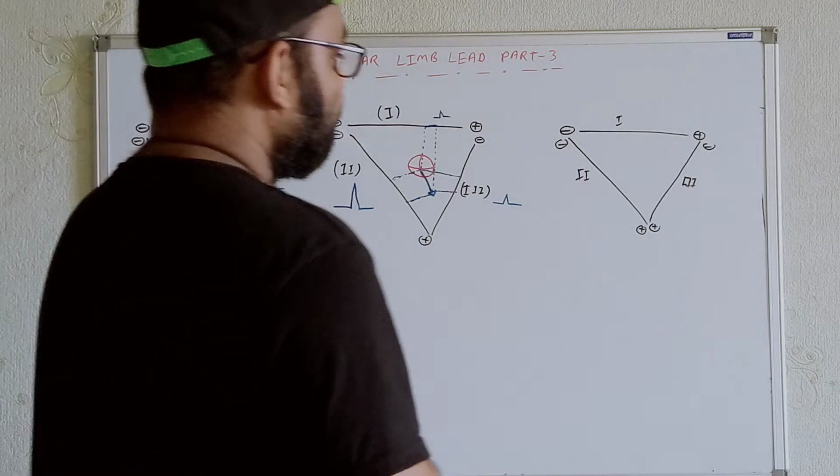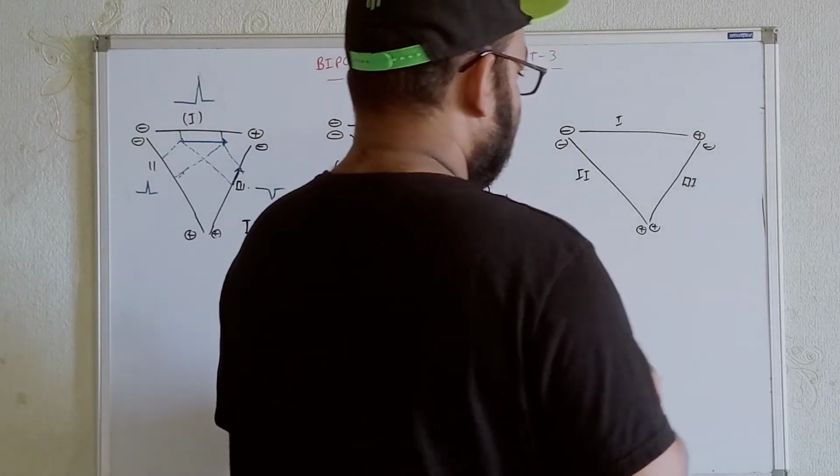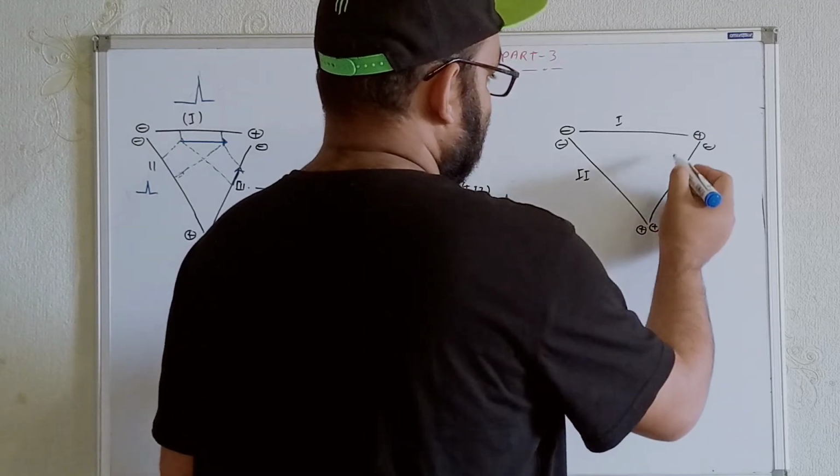Now let's see over here. Now we are getting the major ventricular depolarization, for example, in these directions.